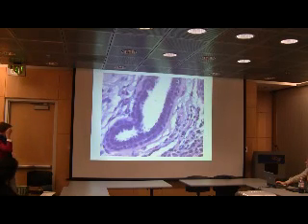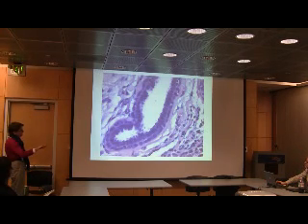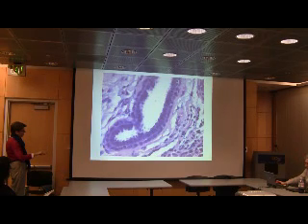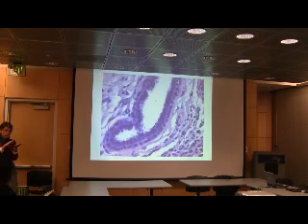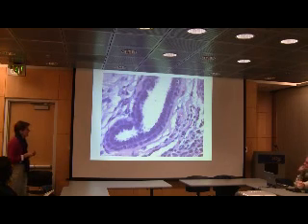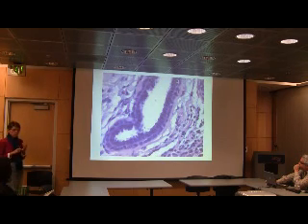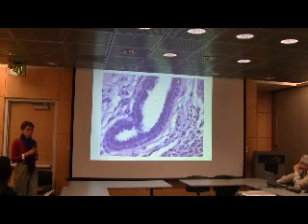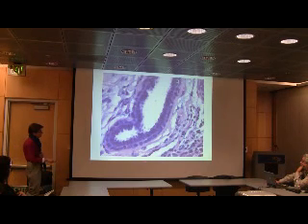All right, so here is the picture where you can really see the two layers really well next to each other. You have the myoepithelial cells lined up really prettily here, and then you have the luminal cells on the inside. So this happened to be cut in a very favorable way where you can really see it. It was actually from a fibroadenoma that has a slightly different type of stroma. You can see a little bit of that. It's a little softer, a little more gelatinous than the typical stroma, and a lot more cellular. There's more cellularity down here. It can vary in cellularity.